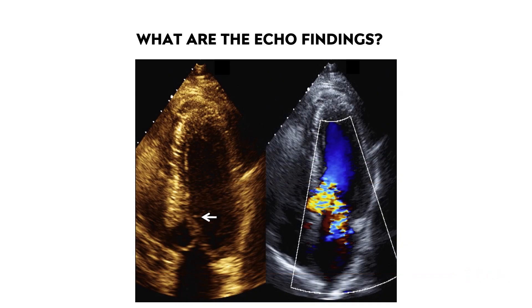Here's another echocardiographic finding of LVOTO. Sometimes you'll actually see SAM — contact of the anterior leaflet of the mitral valve with the septum in systole — but it's harder to see than you'd expect. Since SAM is occurring, the anterior leaflet of the mitral valve doesn't coapt properly with the posterior leaflet, which causes mitral regurgitation.